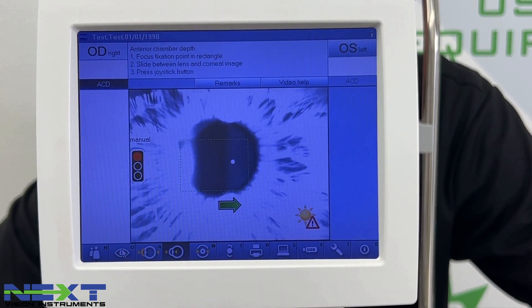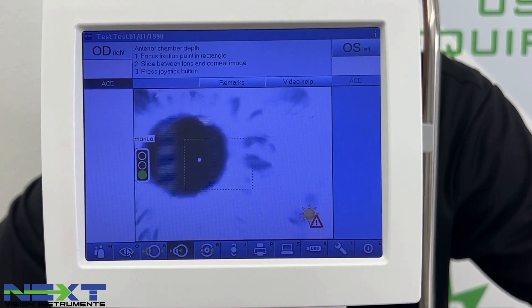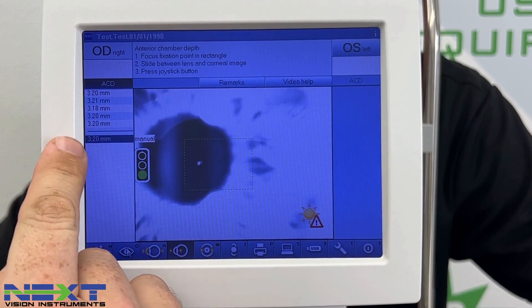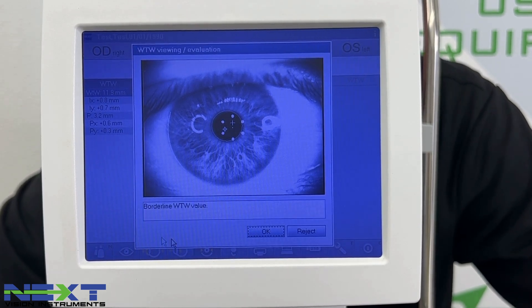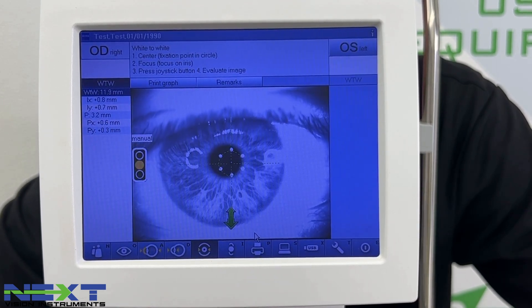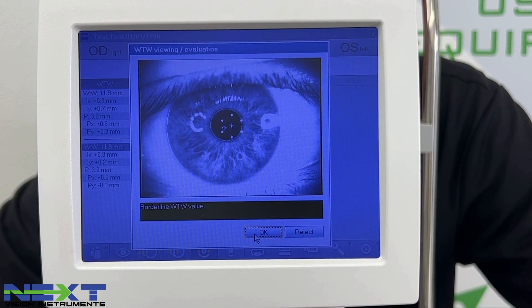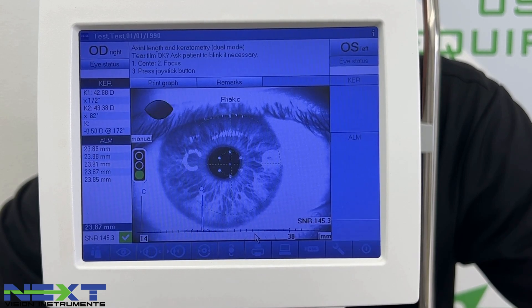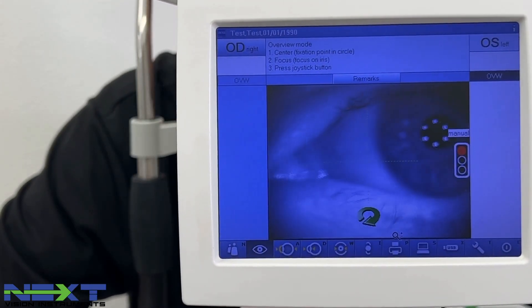For the anterior chamber depth, clear that dot up as best you can, then follow the arrow until you get the green light. Click the button — it took five readings and averaged them. Click the space bar to move between measurements. For white-to-white, center it up, get the image as clear as possible, click the button, click OK, and hit the space bar again. The system then automatically goes back to axial length for the left eye.